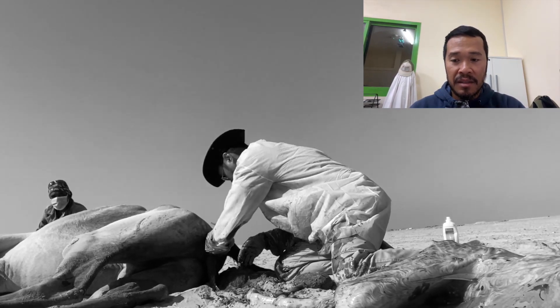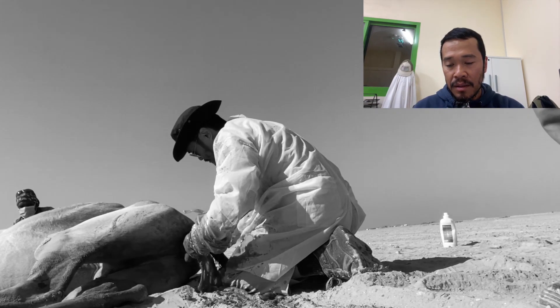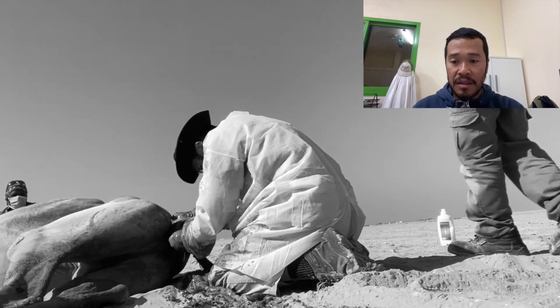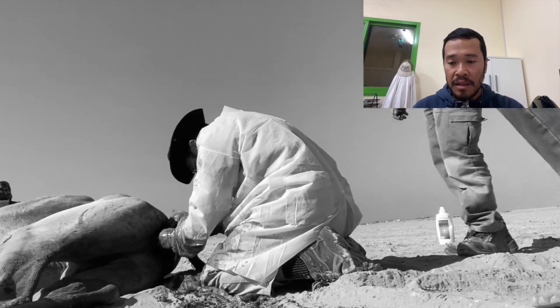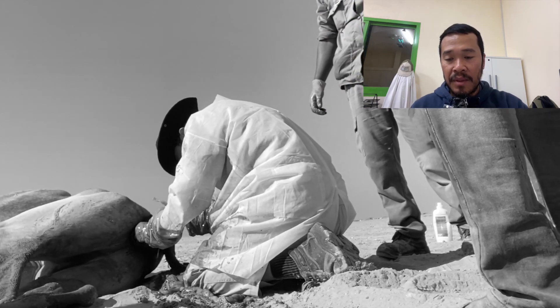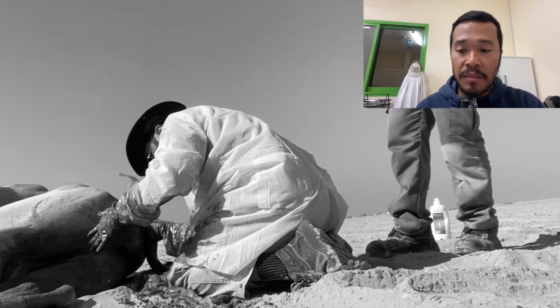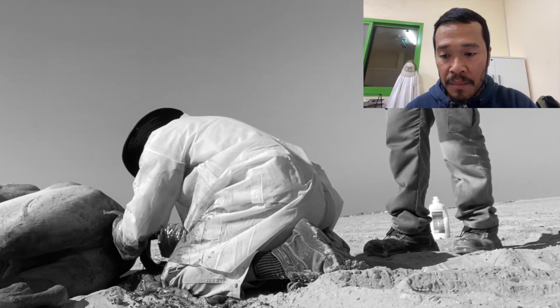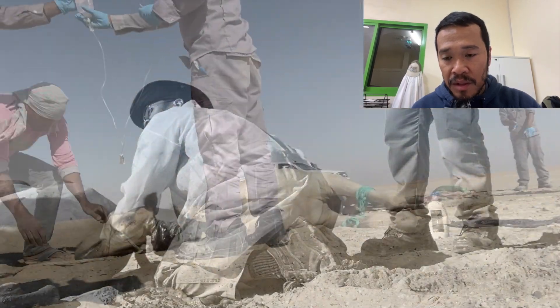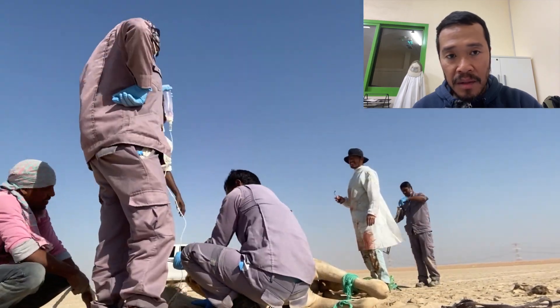There we go. We checked for bleeders — everything is fine, no bleeders. The rest of the placenta is out. The next step is to take care of the dam. There is a slight bleeding but not too much.